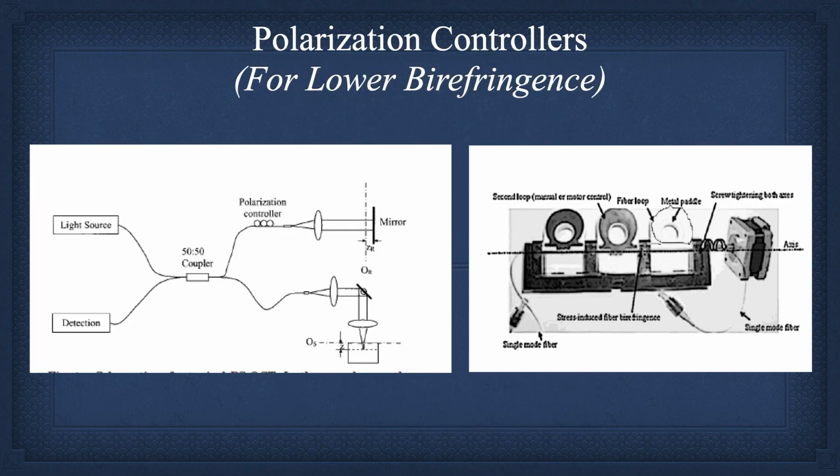So we can shift the banding pattern or the polarization state by putting in polarization paddles. And you see a polarization controller on the schematic on the left. And this just shows the paddles. And these particular paddles come from a paper where they're motorized. I'll bring it up later. It does have its use, but you can do it manually too.